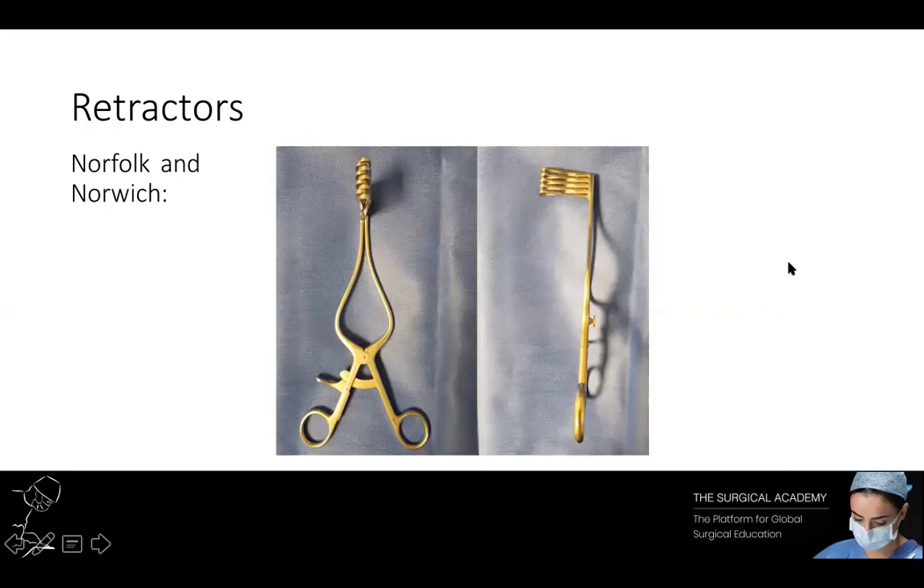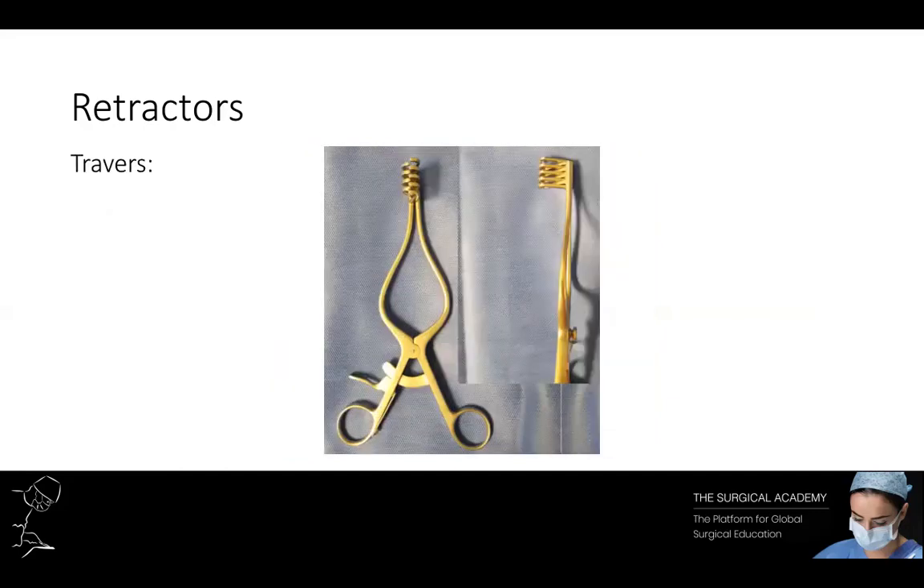The Norfolk and Norwich retractor is a self-retaining retractor used to keep deep wounds and cavities open, with blunt ends to reduce the risk of iatrogenic tissue injury. The Travers retractors are self-retaining retractors with short ends, making them ideal for keeping superficial wounds open.